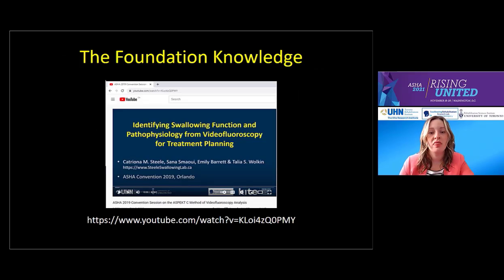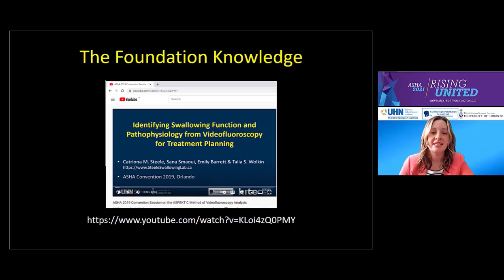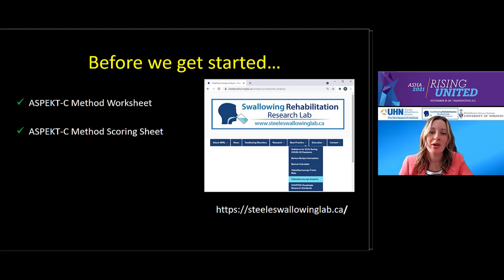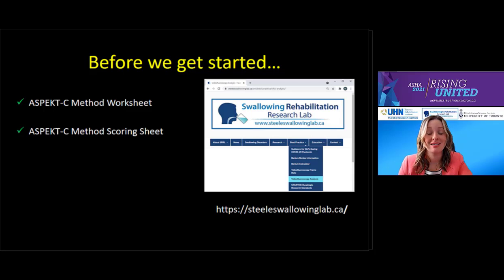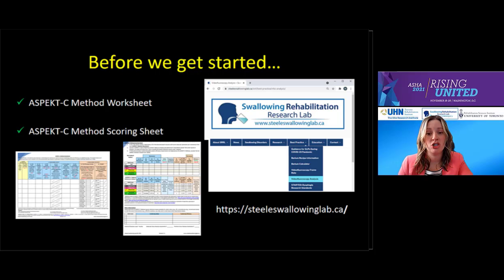While we are releasing updated reference values today — moving from means and standard deviations to percentile-based values — what hasn't changed is how to calculate and measure the ASPECT-C variables. If you're unfamiliar with our tool, our ASHA 2019 webinar is a great place to start. Today, we are applying that knowledge to two case studies, followed by Q&A with Katrina. Our lab website contains supporting material including ASPECT-C instruction manuals and links to webinars, all available for free. As we go through the case studies, have the ASPECT-C worksheet and scoring sheet pulled up or printed out.